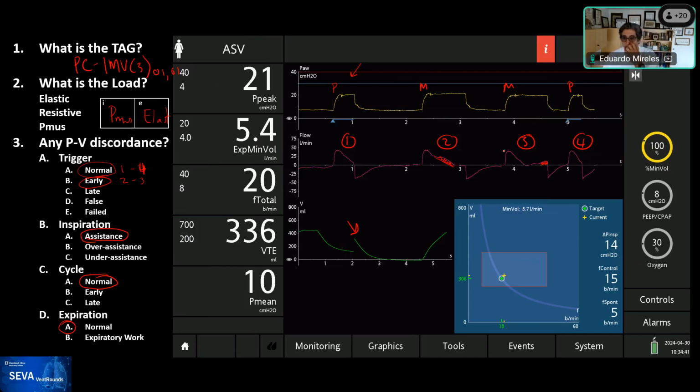And I think what this is talking about is that the inspiratory time set by the machine is too long, and that facilitated these breaths occurring during inspiration. And so it would be hard for me to necessarily call this reverse triggering per se, like it's usually assumed in the literature. Rather, the patient is emerging out, and we were bothering the patient to wake up, and then they started taking breaths through.